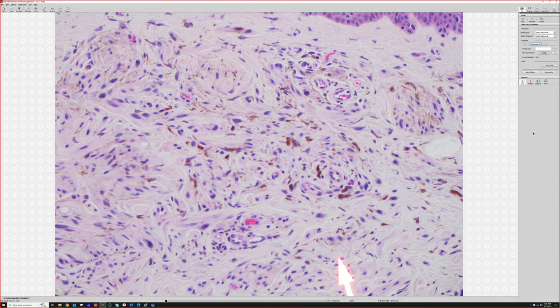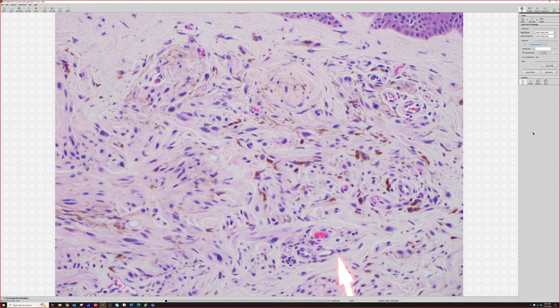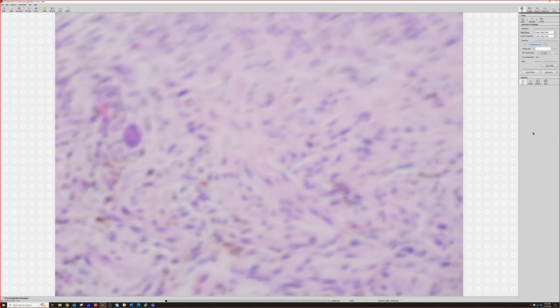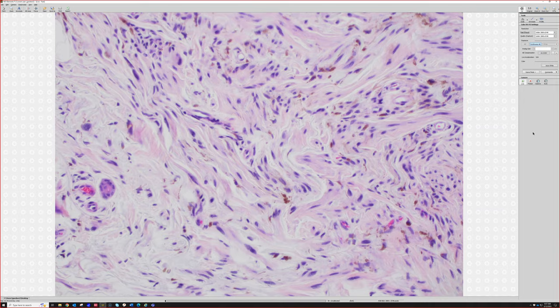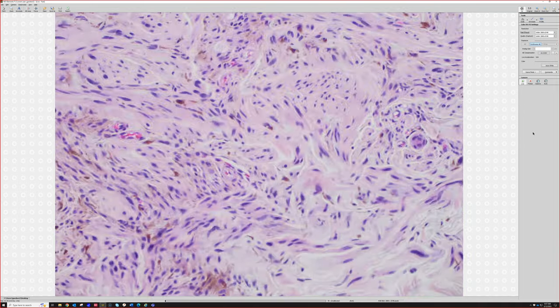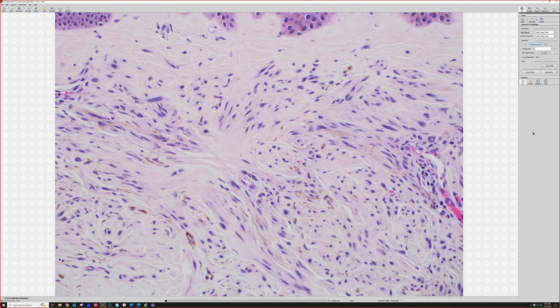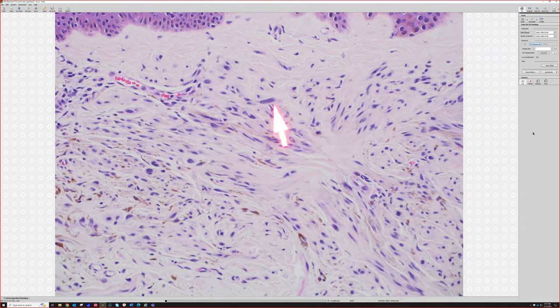And in this case, there were some scattered cells that were kind of enlarged and hyperchromatic, and that's totally fine. That's this random kind of degenerative atypia that we see in regular nevi. We can also see it in blue nevi. I feel like it's pretty subtle here, but some people it might catch their eye and they may say it's kind of like a so-called ancient change in a nevus. What we mean by that is random scattered, enlarged, kind of hyperchromatic nuclei with no other features that are worrisome, right? No mitoses or other features. So random occasional atypical cells in an otherwise normal nevus is probably benign.